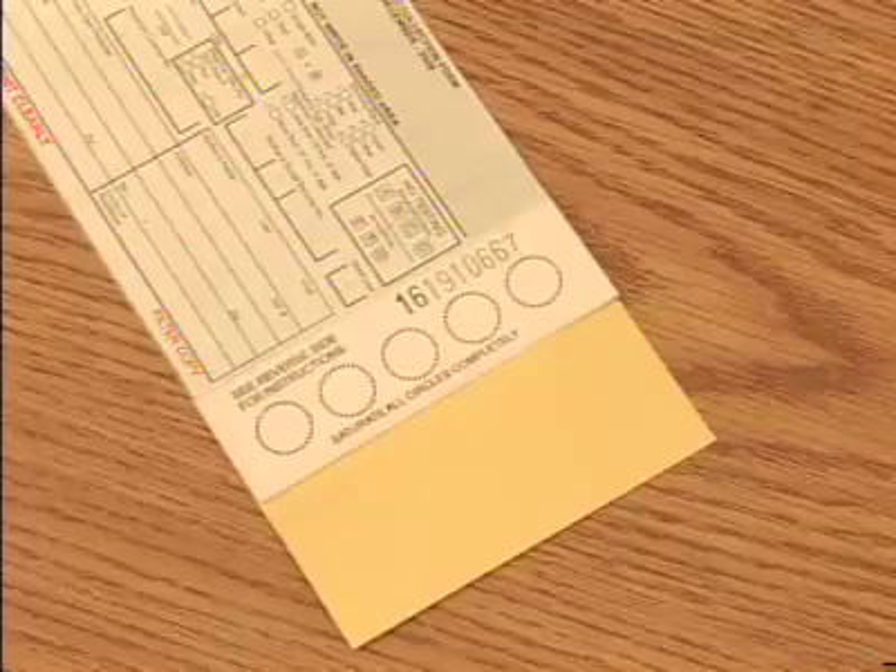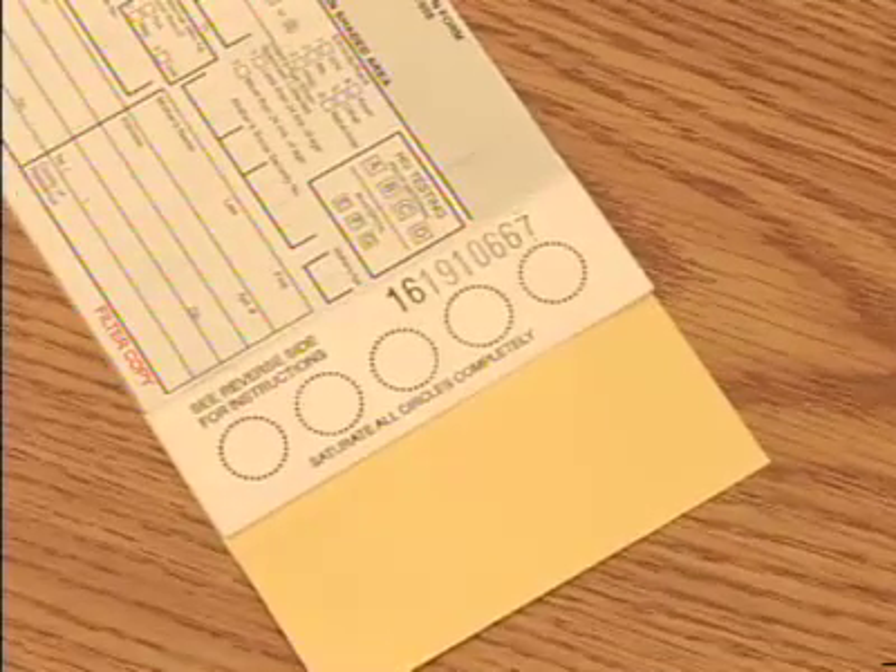To prevent contamination of the sample, do not touch any part of the filter paper circles with your hands or gloves before, during or after collection. Do not allow the filter paper to come in contact with substances such as alcohol, formula, water, powder, antiseptic solutions or lotion. Note that circles are printed on the filter paper portion of the card.